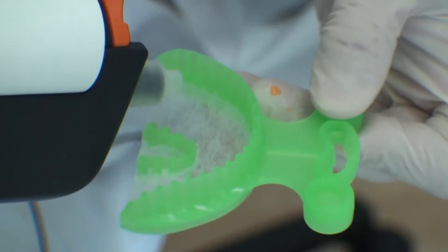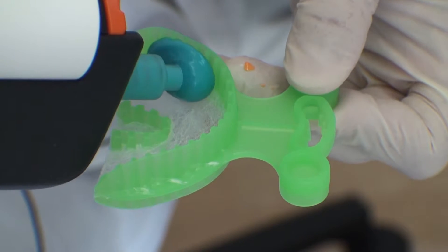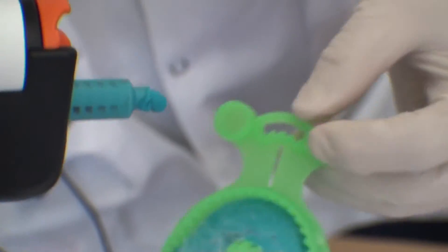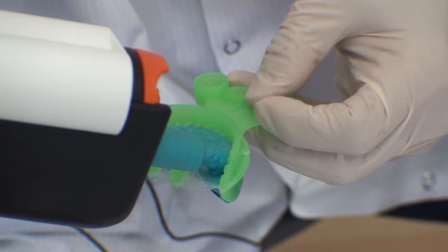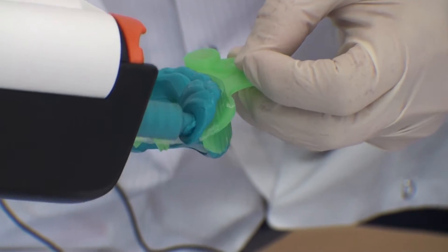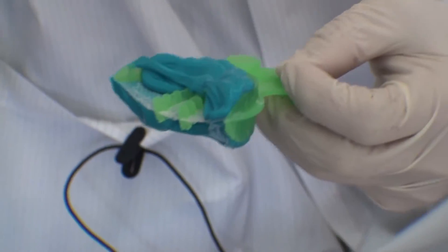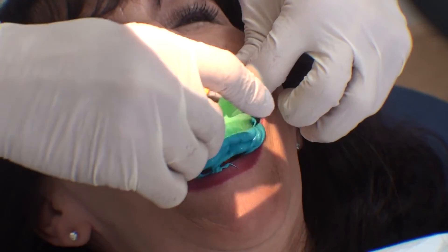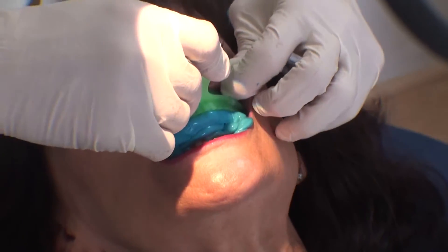The second thing you want to do is to load up the tray with either an automated machine or you can use your standard gun as well. The assistant then hands you the loaded tray. Insert it and have the patient bite.